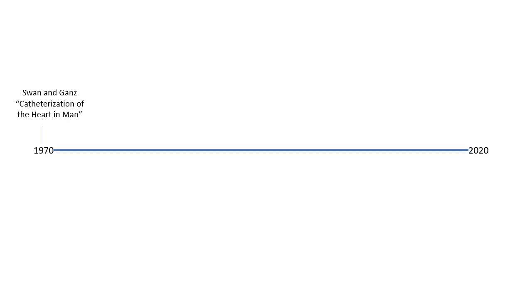Essentially the paper. After they had tested the catheter in dogs, they went ahead and used it in humans, and they talked about how it took about 300 seconds or so to get the catheter inserted and get a wedge pressure on the humans that they tested. Shortly after that, the product was commercialized, and the use of the PA catheter grew exponentially, and at one point it was being used in over 20% or more of critically ill patients to help guide their management.